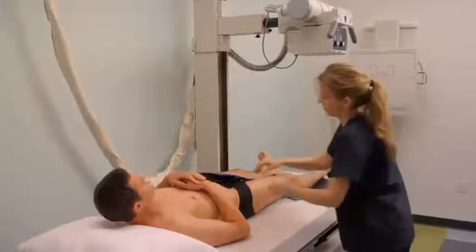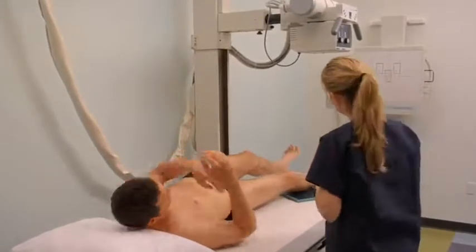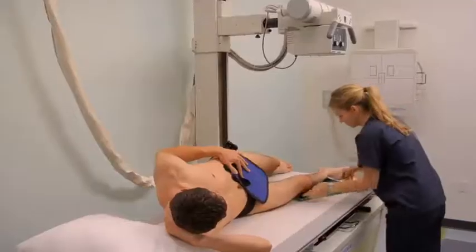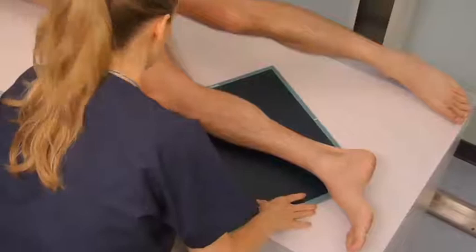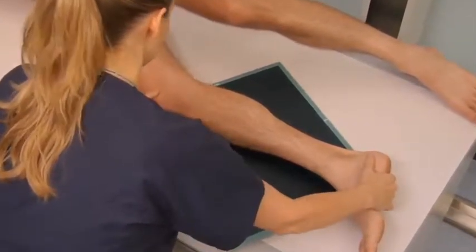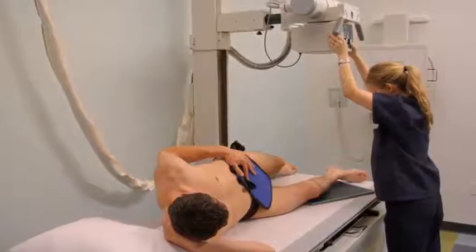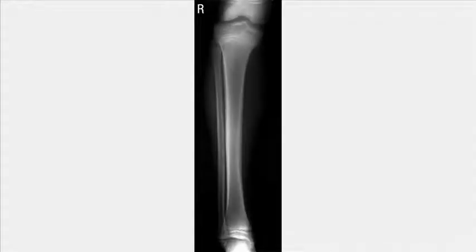To obtain a lateral tibia fibula projection, ask the patient to rotate their entire body towards the affected side. Flex the knee of the affected side 45 degrees and position the other leg behind the affected limb. Confirm correct positioning by palpating the malleoli and patella. Ensure that the knee and ankle joints are included. Direct the central ray to the midpoint of the tibia and fibula. Expose, process, and review the images obtained for all projections.